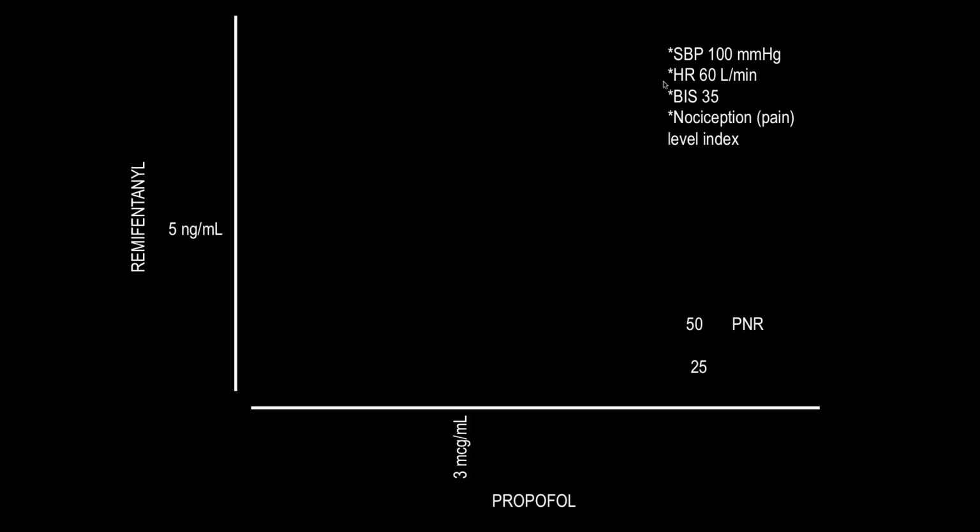We are in surgery on a male patient who is undergoing a laparoscopic cholecystectomy. The systolic pressure is 100 millimeters of mercury.